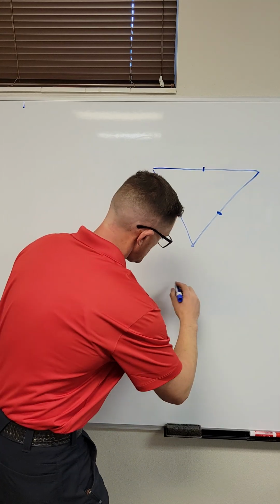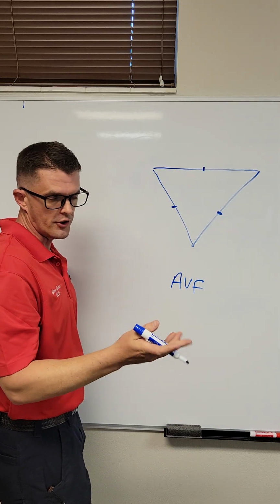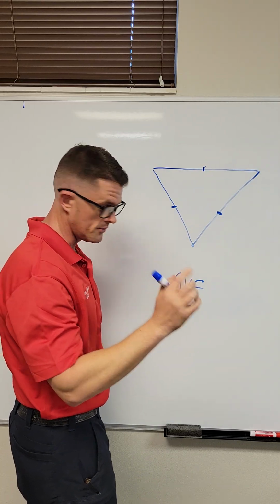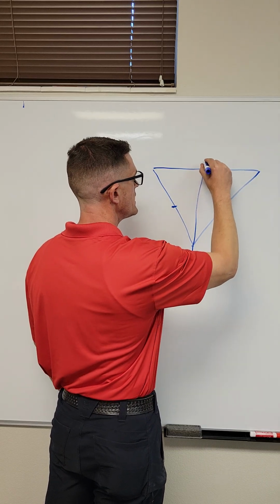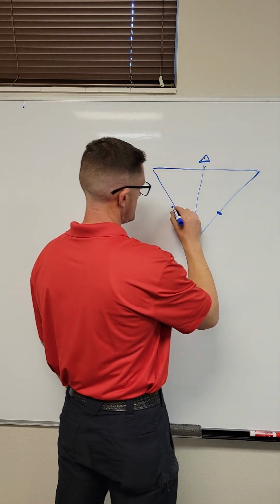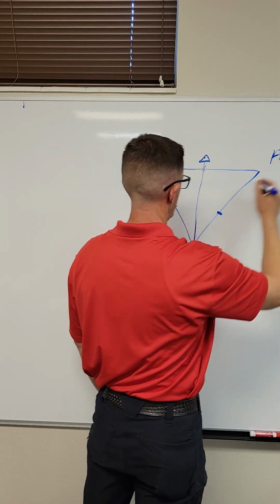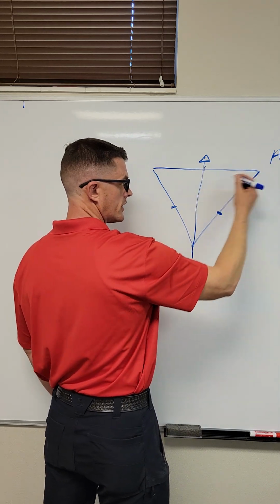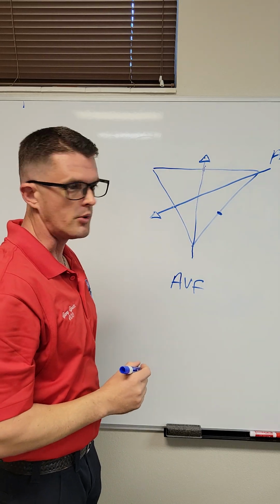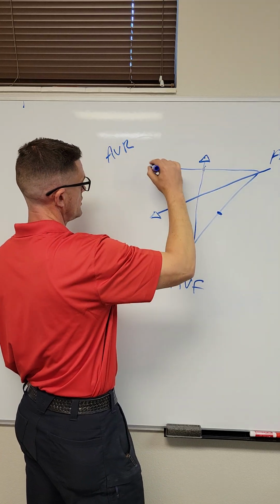Now what it can do is take AVF, for example, augmented vector lead foot, whatever you want to call it. Takes that measurement, and now this being a looker, so it's positive, can look up at this new created negative that your monitor has made for you. And it can do the same with the other two. Take this guy and this guy, we can go augmented vector lead left. Takes that, and that is the looker, so it's looking down in this direction. Okay, that would be the new negative. That's the new focal point. Same with AVR. Okay, and then this guy technically looks in this direction.